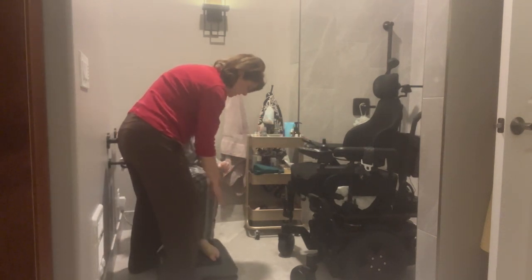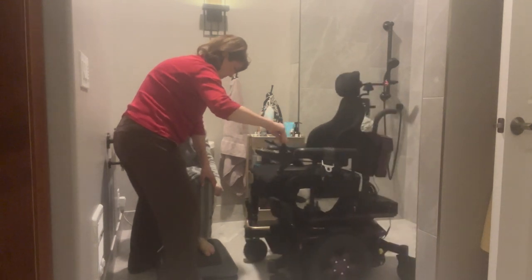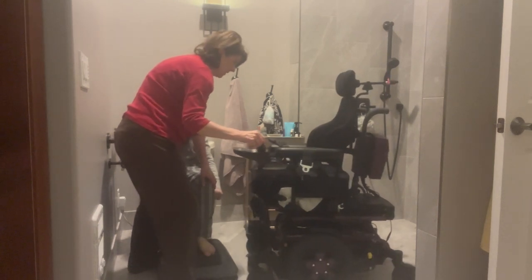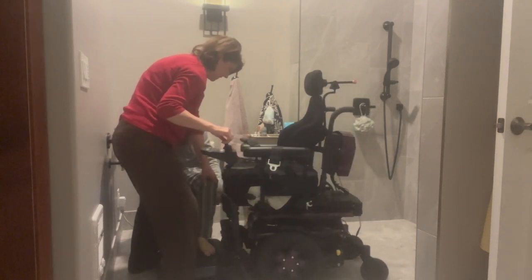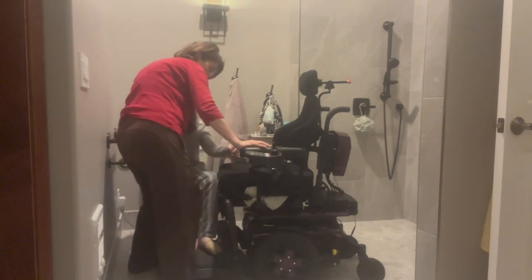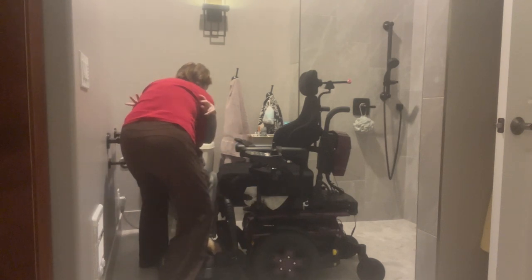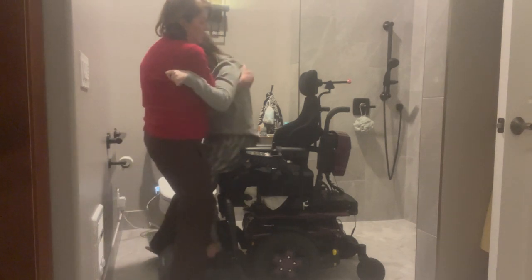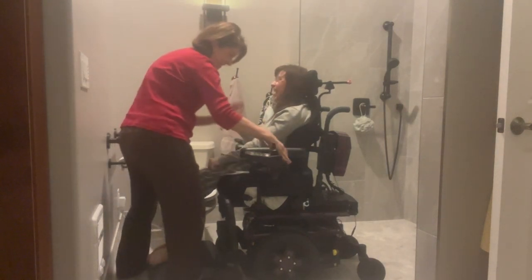I do this little step and make sure her knees are bent. I shift this around — as you can see, it fits perfectly between her wheels — and then I move back the joystick to give me a little more room. On the count of three, I use my leg to block her leg — one two three — and that was a good one! We're very excited because that was a good one for the video.